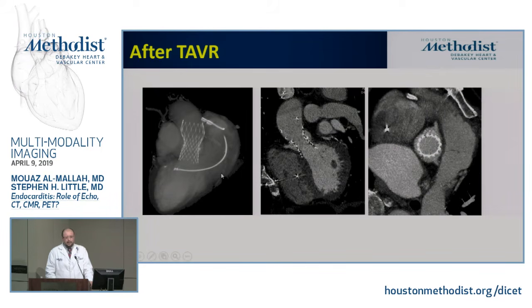In 2012, I had in my practice one patient who had a valve implanted, and this is her CT after the valve. She was living in another city, and she started to develop UTIs, one time even admitted to ICU with urosepsis, and everything was reported as okay in the other city. Later on, she was brought in frank pulmonary edema. Transthoracic echo showed a mean gradient of like 45.